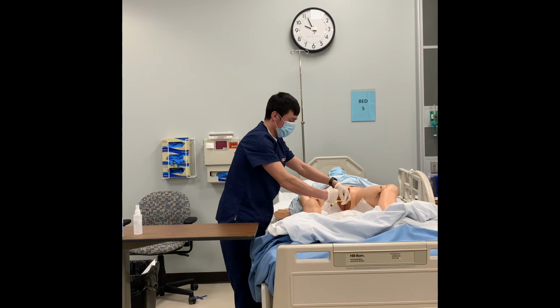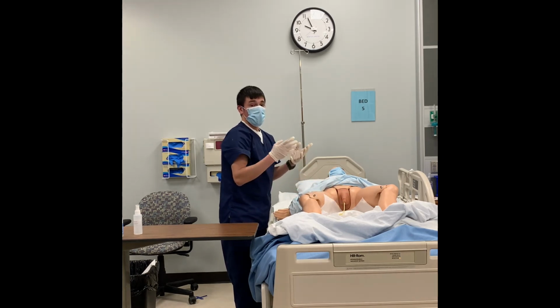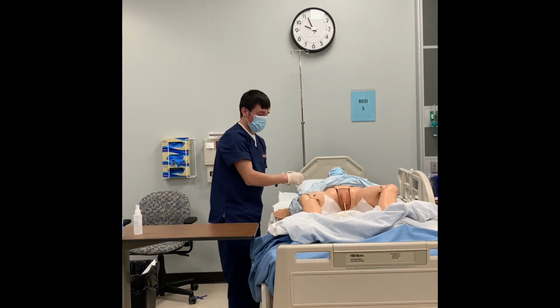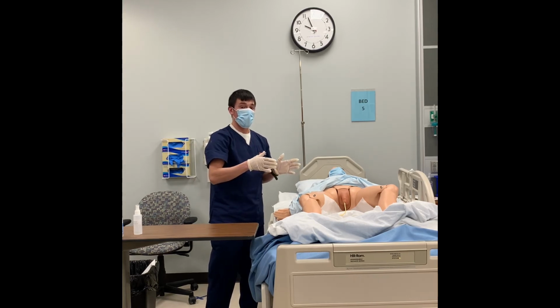All right, so now that the balloon is inflated, I'm going to take it off, drop it there, and now from here, it's no longer a sterile procedure. I can touch around here and I can grab it, attach it to the stat lock, and then put it onto the bed, making sure that it's below the height of the patient and below the bladder of the patient as well, and put it on the part of the bed that does not move.